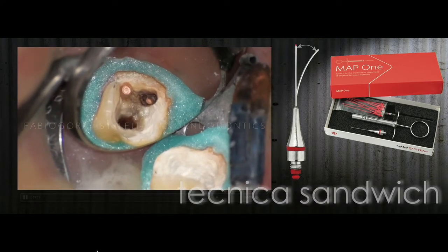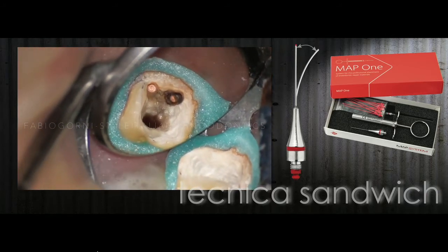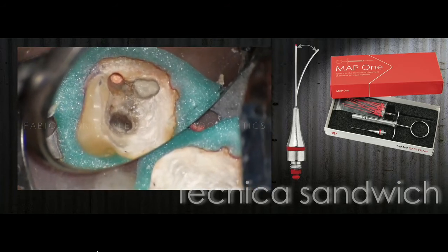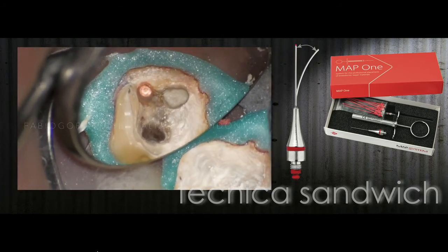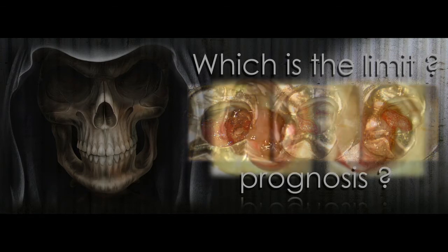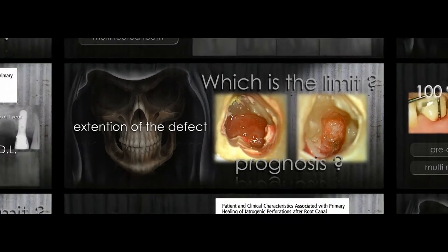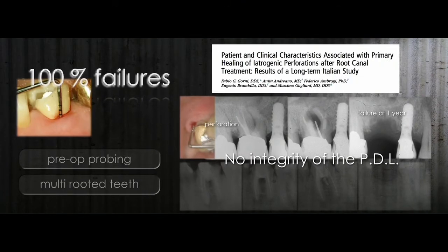Now the therapy is finished, and it will be very easy to push the MTA into the space to close everything in a sandwich technique. Which is the limit? We already talked about it. The limit is the dimension of the lesion. In the past, we tried to repair huge perforations, but with a lot of failures. So that's why the extension of the defect is one of the most important aspects that we have to understand.